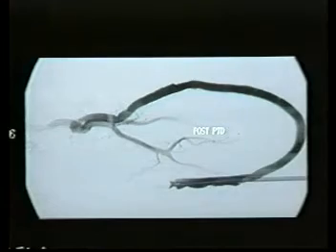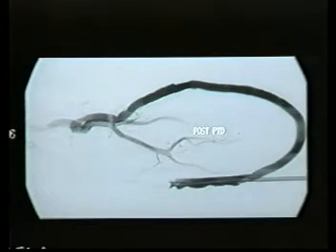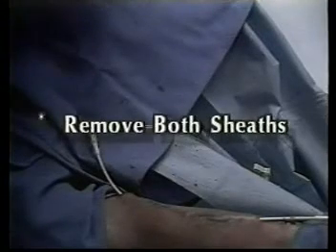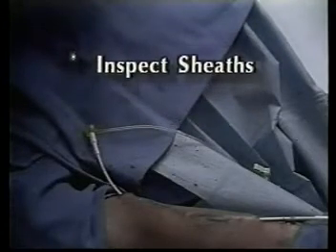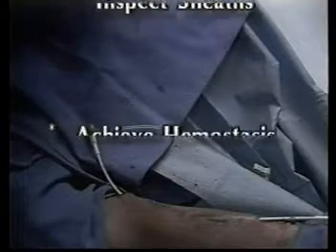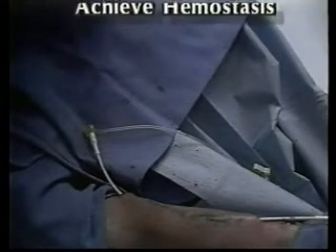When thrombolysis is complete, any underlying disease or stenosis should be further assessed by fistulogram. Remove both sheaths from the graft. Inspect the sheaths to be sure the entire length has been removed. Hemostasis of both sites should be achieved according to hospital protocol. The patient may now be transferred for dialysis.